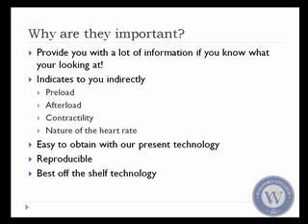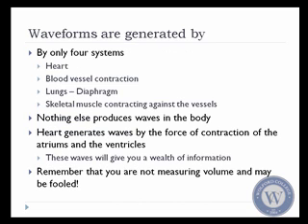Now, what makes pressure transducers, as well as other non-invasive ways of looking at pressure, so useful is that it's a relatively easy technology for us at this point, and it's reproducible, and it's really one of the best off-the-shelf technologies that we have right now.